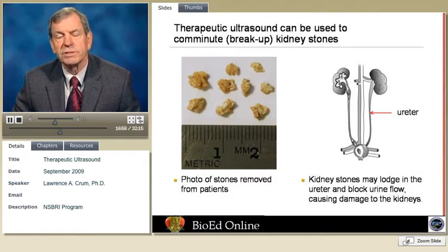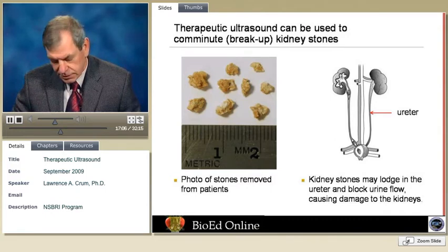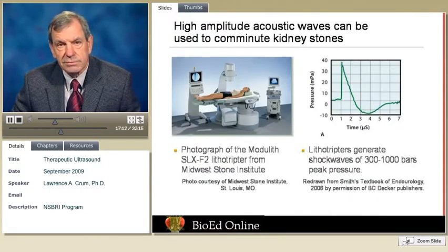So what about this condition then? Let's suppose that someone is going to Mars or the Moon and having an impacted or an occluded kidney stone, an occluded ureter. How could one treat that? Well, on the Earth, we have these enormous systems called lithotripsers, in which one usually lies on a table or bed, and shock waves, very intense shock waves.